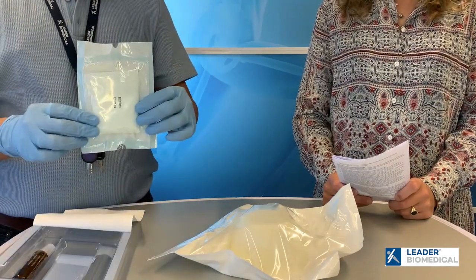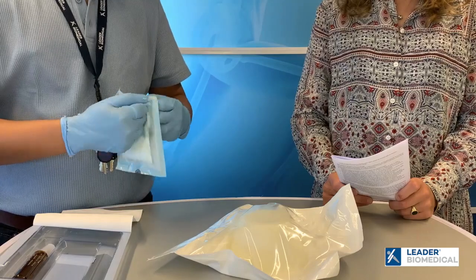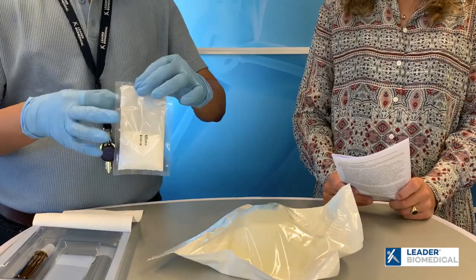Taking out the powder first, which is in the pouch. Just until it is like this. We will leave it for now.